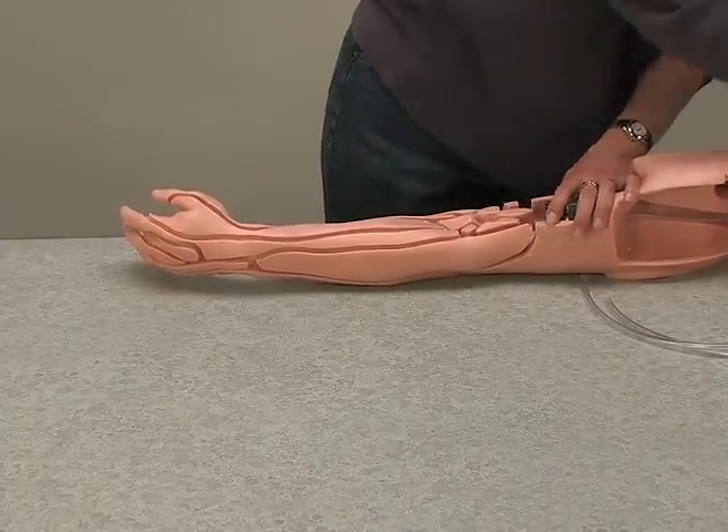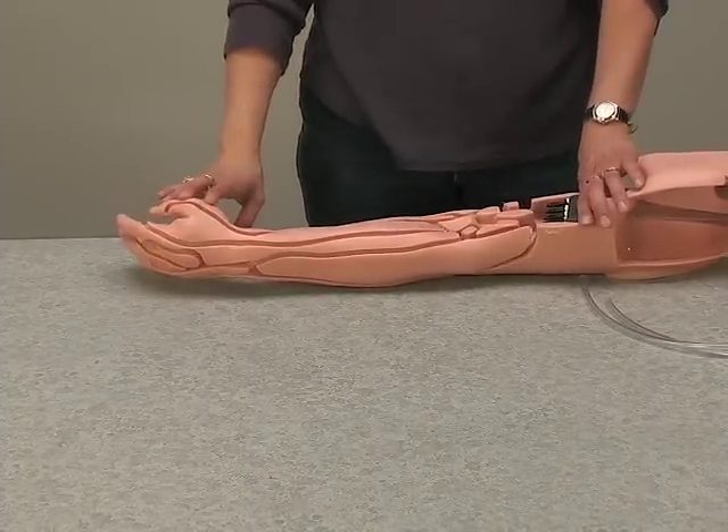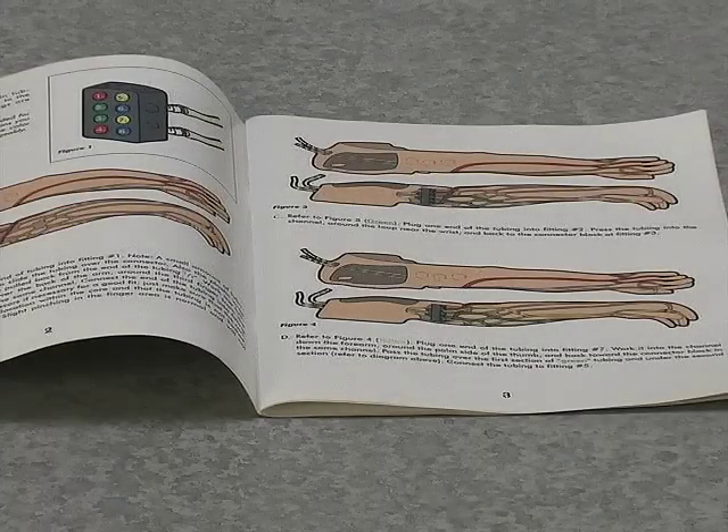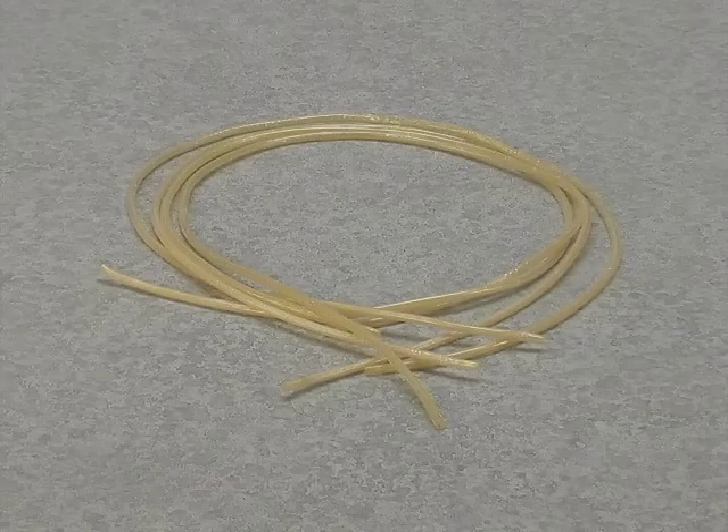You are now ready to install the replacement skin and veins. Please follow along in the color-coded instruction manual — this will enable you to install the veins correctly. In the kit you receive four replacement veins of the same color and length, and they may be used interchangeably.